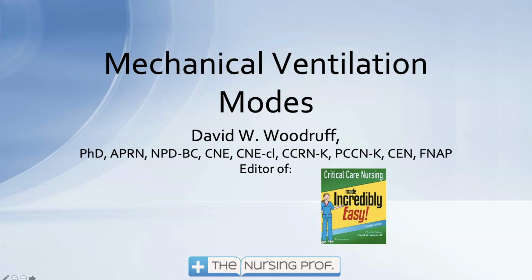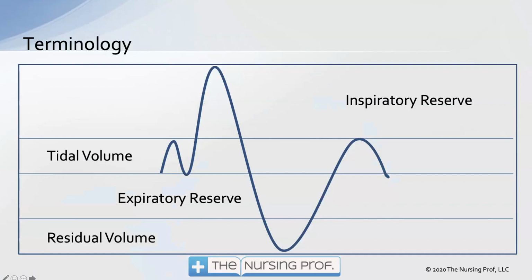Today we're going to talk a little bit about mechanical ventilation modes. This is the second in our series on mechanical ventilation. So let's review some of the terminology that's used with mechanical ventilation.